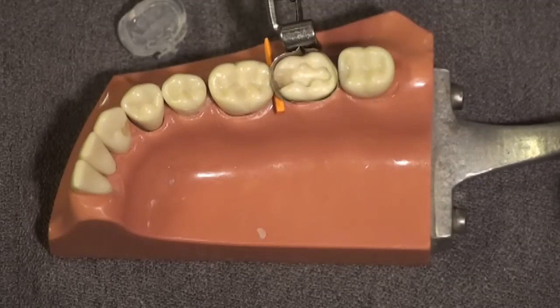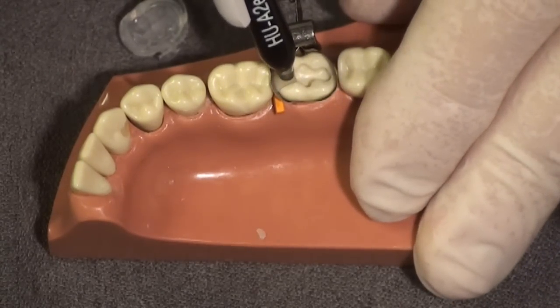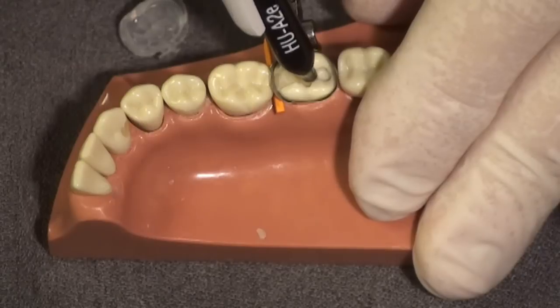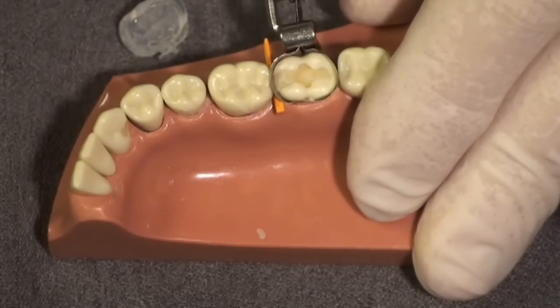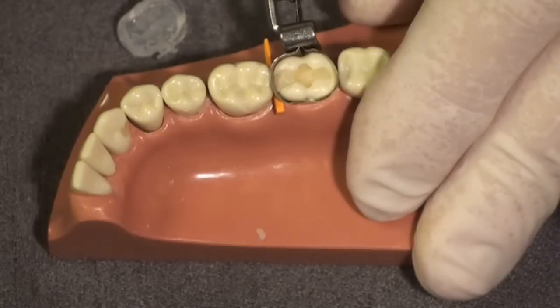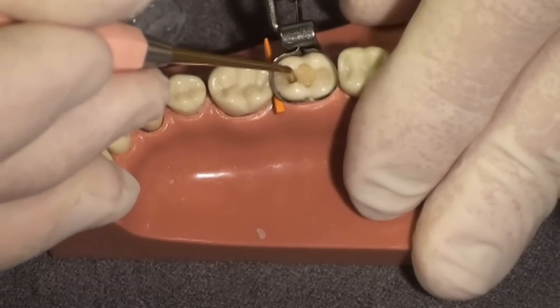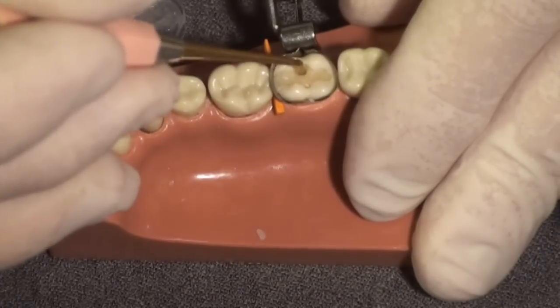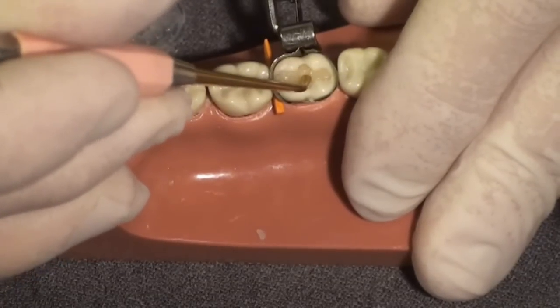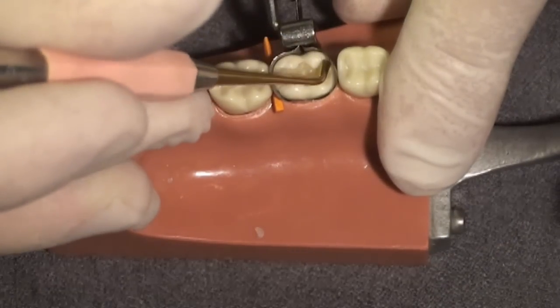The key trick to the clear custom matrix technique is only placing a slight excess of composite as your last increment. Dentists, myself included, have been taught to place more composite than needed and then grind away the excess. With this technique you don't want a lot of excess because that will simply be flashed.